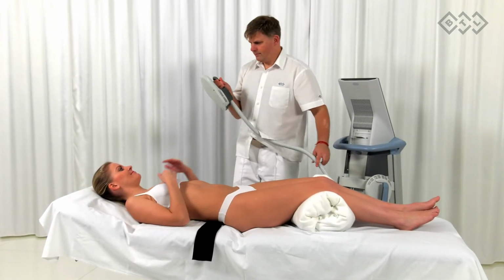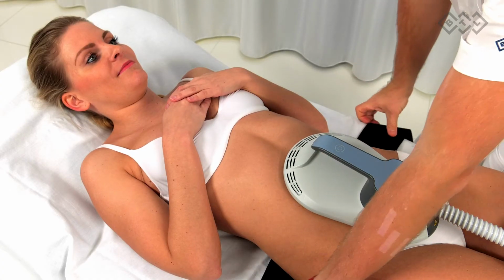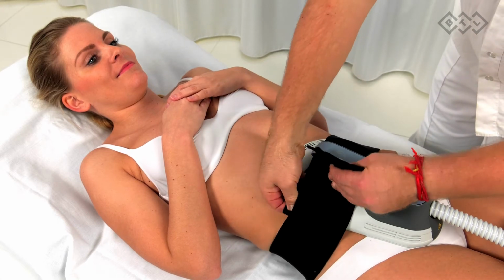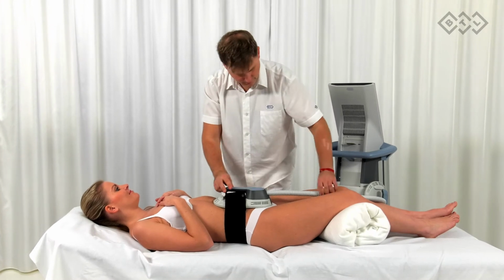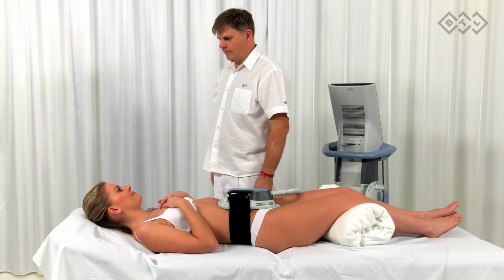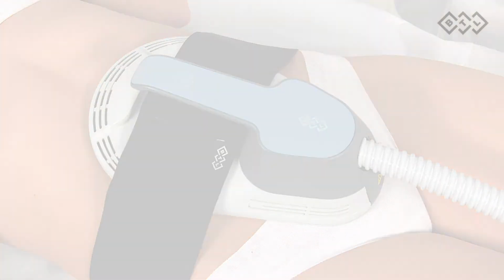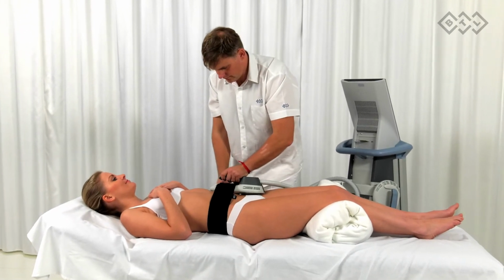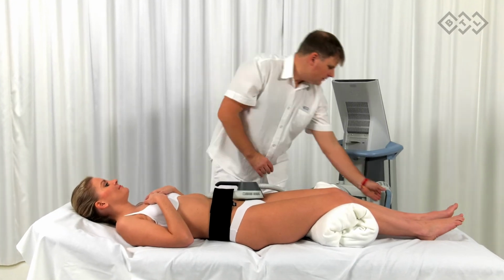Place the applicator on the area to be treated and secure it with the fixation belt supplied with the device. Make sure that the applicator is adequately secured to avoid any applicator movement during the treatment. Do not treat directly over bony areas. Make sure to keep the applicator positioned symmetrically over the treated area. For bigger patients, use 2 applicators at the same time to ensure complete coverage of the treatment area.